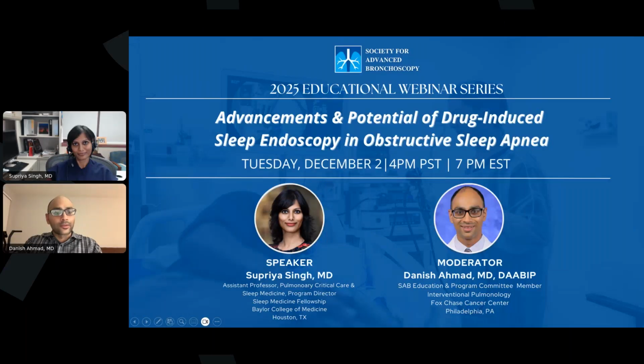So definitely something that I can see recommending to my patients, or actually sending someone to sleep medicine for better evaluation. One of the things that one of the audience members asked was, you mentioned how DISE is used for planning of upper airway surgery, for PAP optimization, for oral appliance use or hypoglossal nerve stimulator placement.